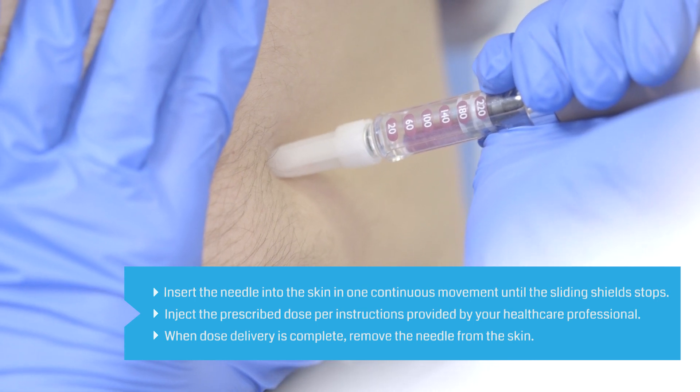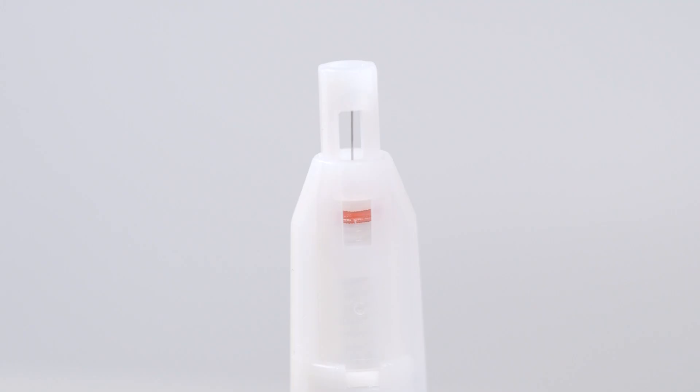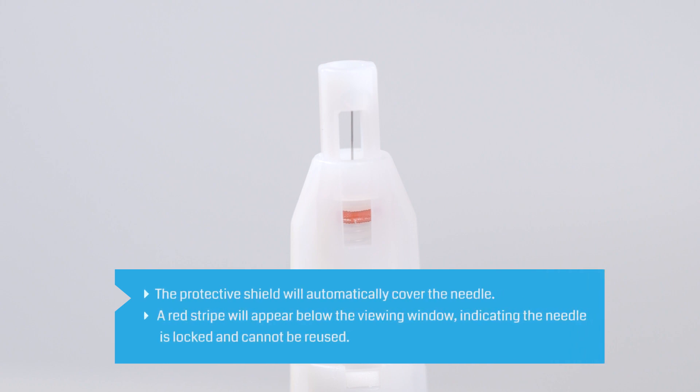After the injection, carefully remove the needle from the skin. The protective shield will automatically cover the needle. A red stripe will appear below the viewing window, indicating that the needle is locked and cannot be reused.